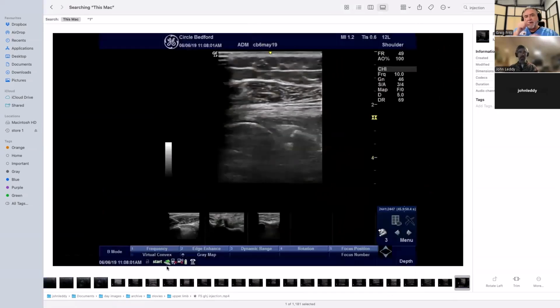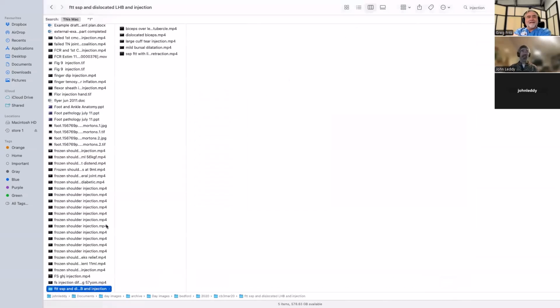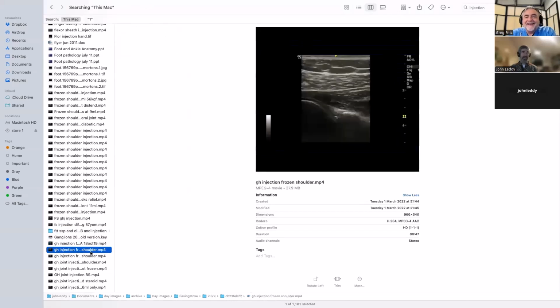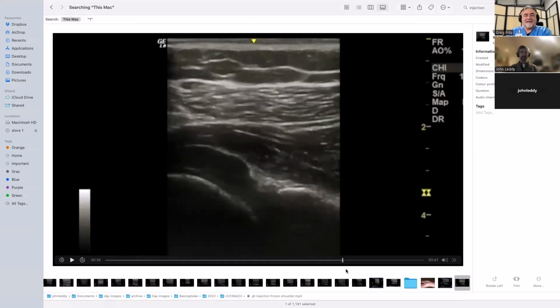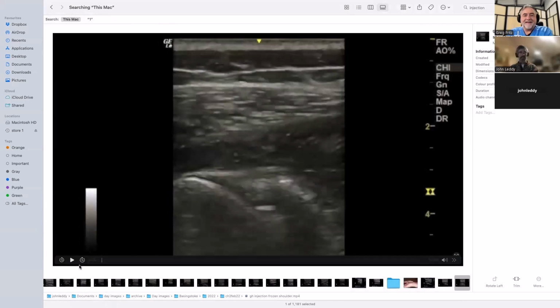Do you think that they would prefer to feel the bone strike and then bring it up in order to do it? No, I know some good people who do it that way, and I cannot. They look at me funny when I do it my way, and they say they like to do it that way, and I just go, okay. So there's more than one way to skin a cat. I just think this way is so straightforward.